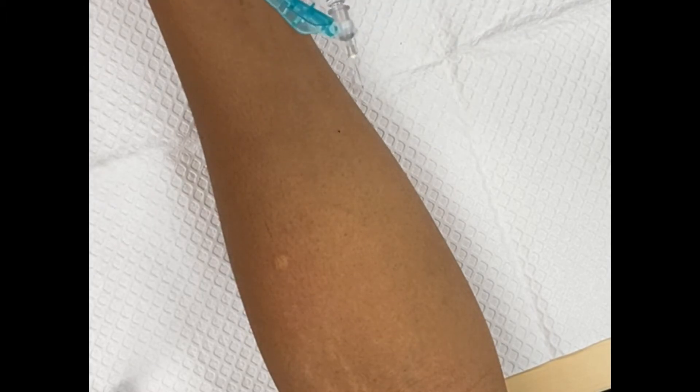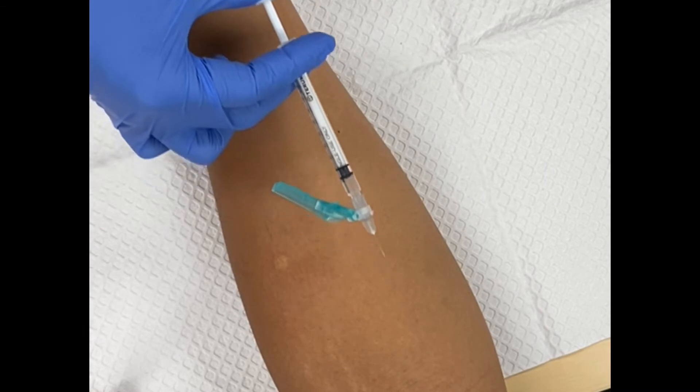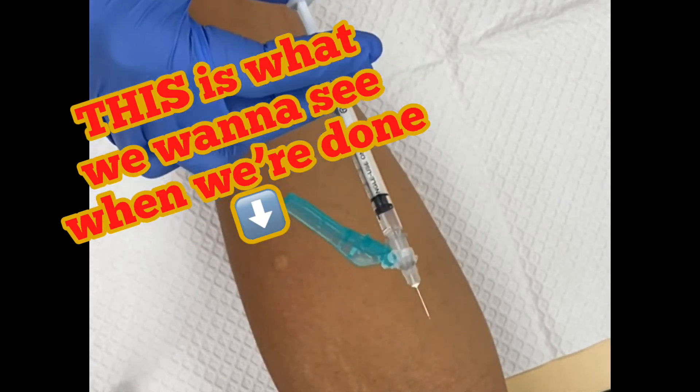When we are doing a TB test, remember intradermal injections are at a 15-degree angle — you're almost laying on your patient's skin, almost parallel to the skin. Make sure your bevel is up; that's the opening of the needle.